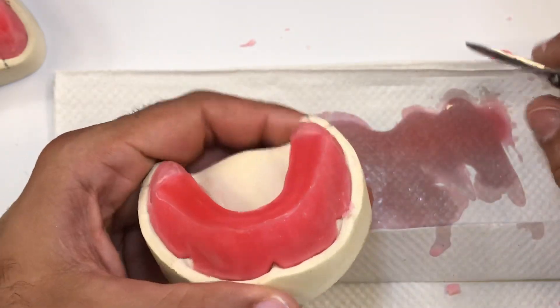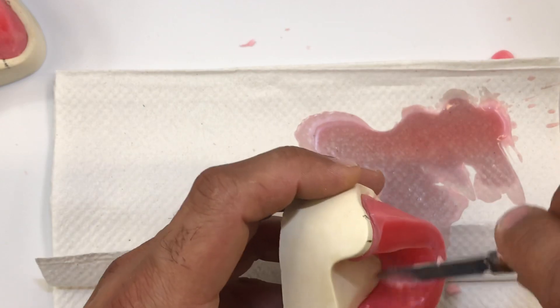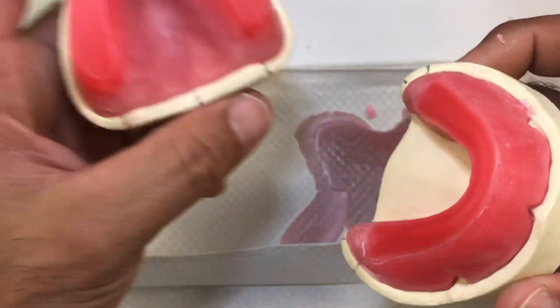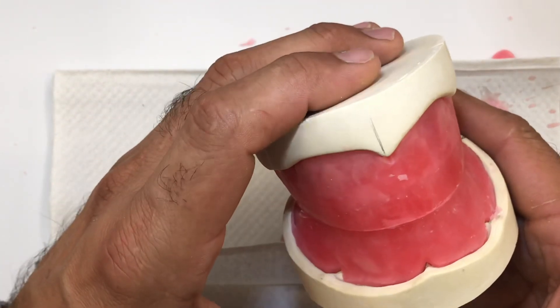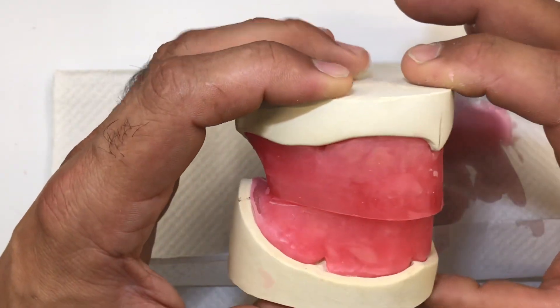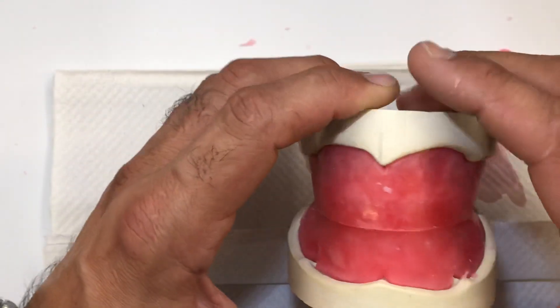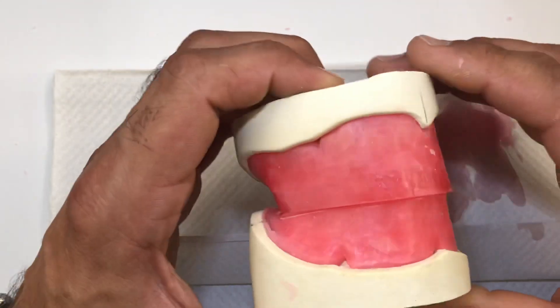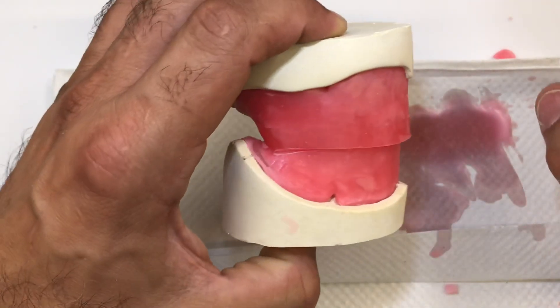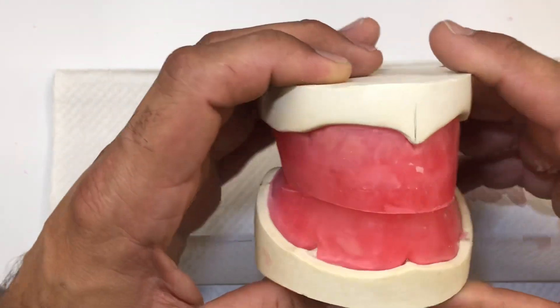I think that's as far as I'd like to go in terms of the height — just a quick once over. This being a class one jaw relationship scenario, if I hold the blocks tentatively together, you notice how the bite blocks are pretty much in line with each other and the bases are parallel. There's a slight little overlap of the upper occlusal rim over the lower, just like natural teeth. There's a slight overlap due to the labial inclination of the anterior portion of the maxillary rim versus the lower being pretty much straight up and down. That would be ideal — not necessarily what we'll have in the patient's mouth, but this is a good starting point.